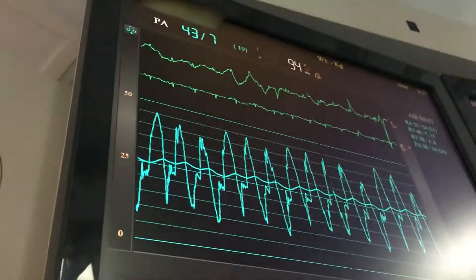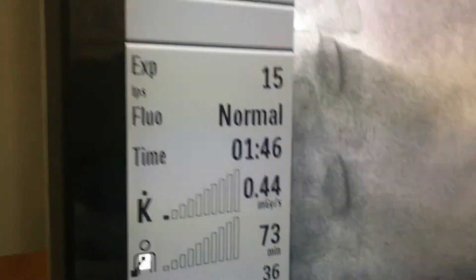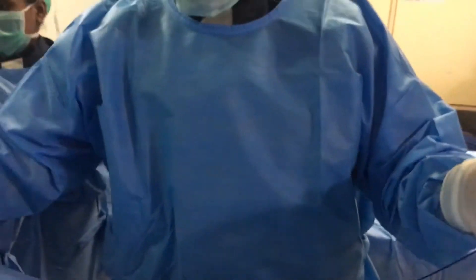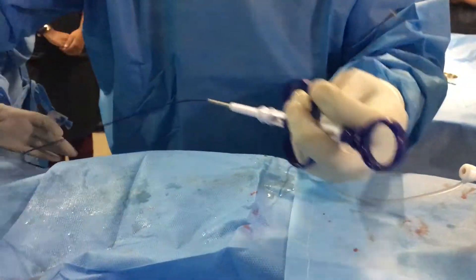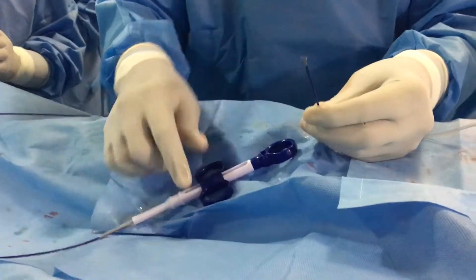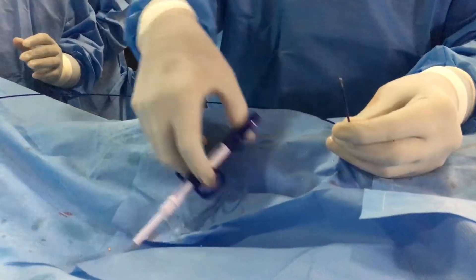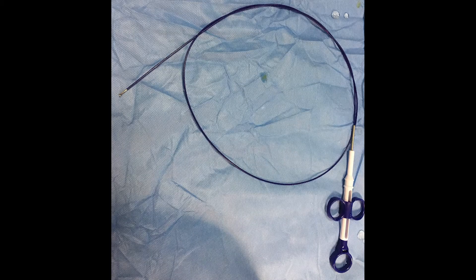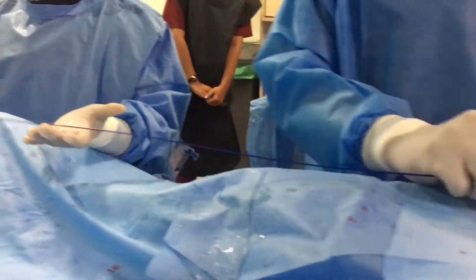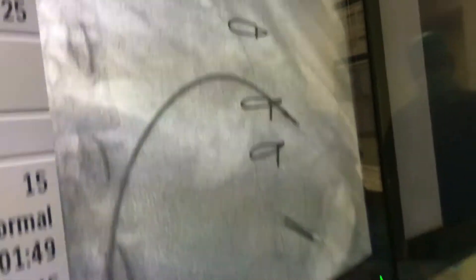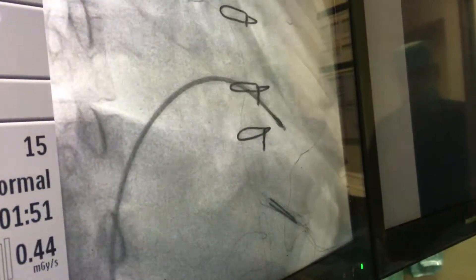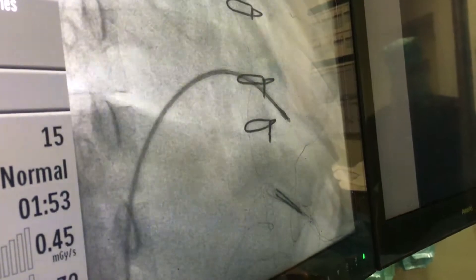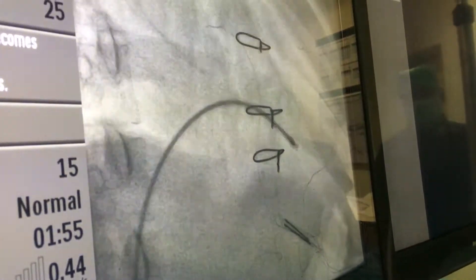And so we'll be taking the sample from the RV septum, RV side of the septum, and that also in the apical septum. So we can show this bioptome forceps. Wait, let me take this. So this is the bioptome forceps. So actually here, this is easily closed. It's very flexible. At the same time, it's stiffer. Okay, so now you can see that I have entered RV. So in the RAO view, we are close to the RV free wall.